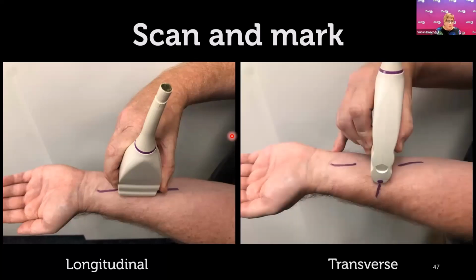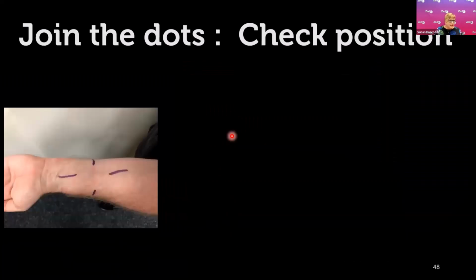I then find the foreign body in transverse, and I take care each time here, I want the foreign body to be right in the middle of my screen. And so then I pop the probe on in transverse and I mark the end of my probe again. Now, what that leaves me with is markings on the skin like this.